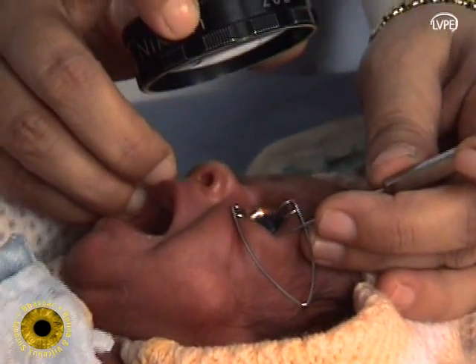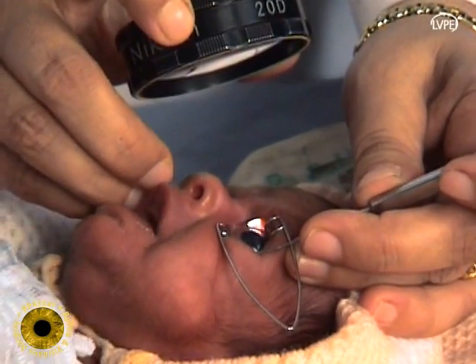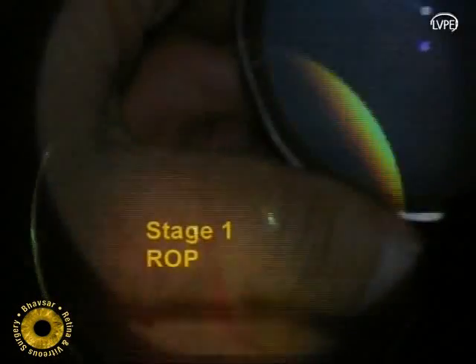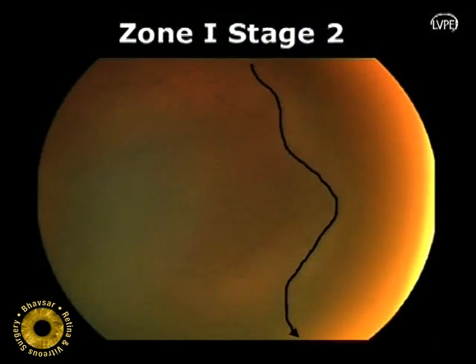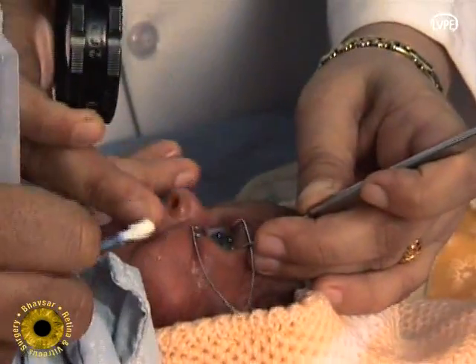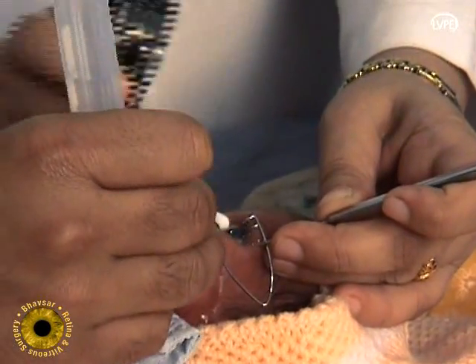A 20-diopter lens is used to focus the laser beam on the avascular retina. We usually start the laser in the temporal retina and then go around clockwise or anti-clockwise to cover the entire avascular retina up to the ridge. Constant hydration of the corneal surface is achieved by instilling drops of Ringer's lactate solution.